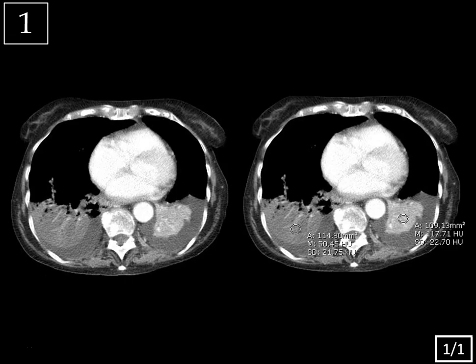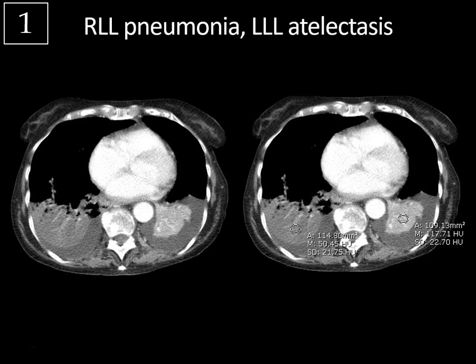Case 1, CT chest. This is a nice example of right lower lobe pneumonia and left lower lobe atelectasis with bilateral pleural effusions.